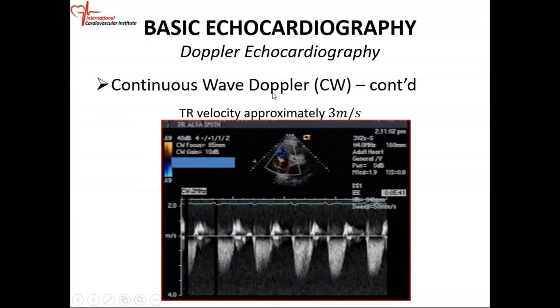Tricuspid regurgitation, similarly: the cursor is right there, short axis at the aortic valve level, cursor across the tricuspid valve, and you're getting flow below the baseline. Therefore, you have a flow moving from the right ventricle across the tricuspid valve into the right atrium — tricuspid regurgitation. It's below the baseline because it's moving away from the transducer. You have to use CW because these velocities, the majority of the time, are greater than 2 meters per second — you have to use continuous wave Doppler.